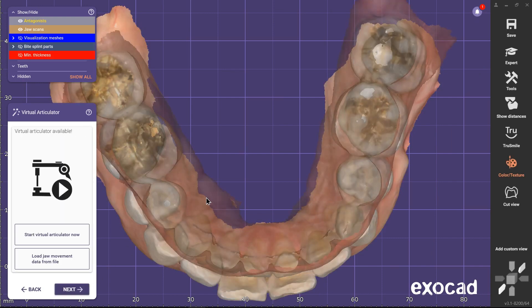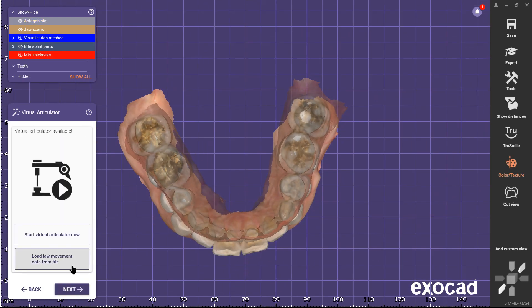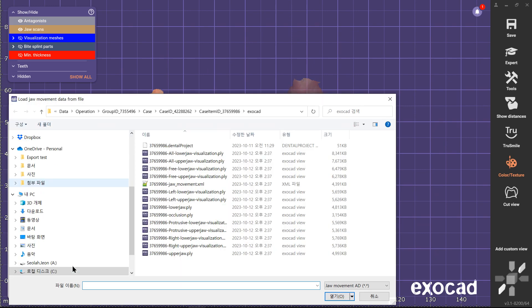In the Virtual Articulator, click Load jaw movement data from file. Choose the XML file you want to be loaded.